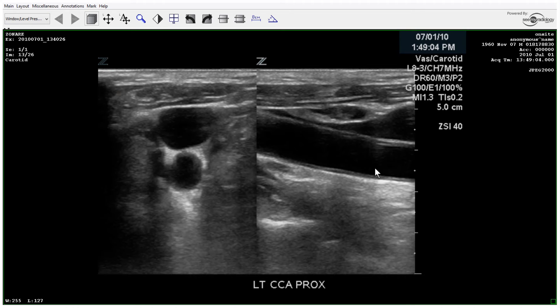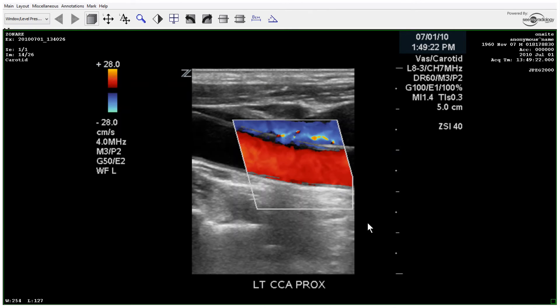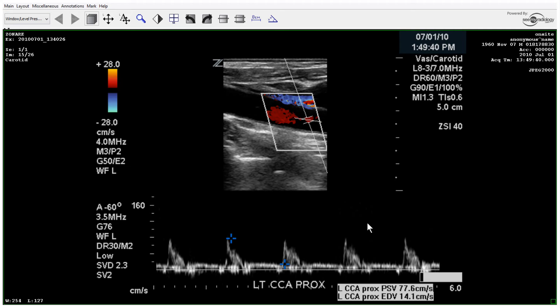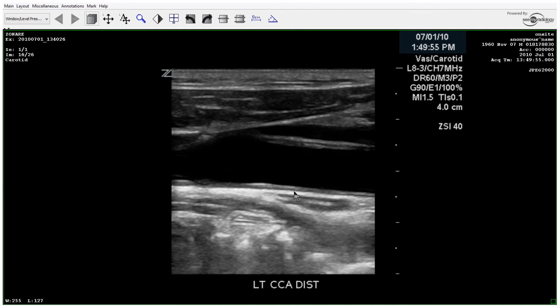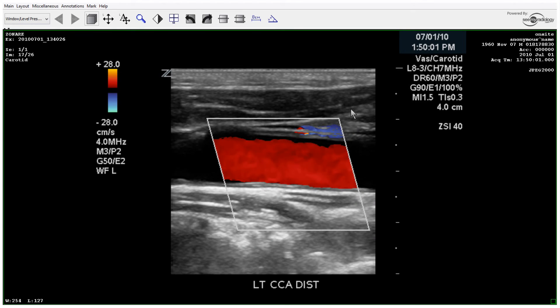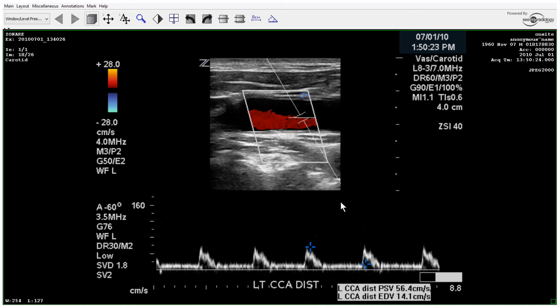The vertebrals are antegrade. Now we move to the left side, again beginning at the proximal common carotid in transverse and long axis. You can see the color and spectral Doppler — velocities are pretty decent, fairly normal waveform, a little bit of intimal thickening, very mild. A teaching point: we could decrease our spectral Doppler scale to make the actual waveform fill more of the window, as it seems awfully small.